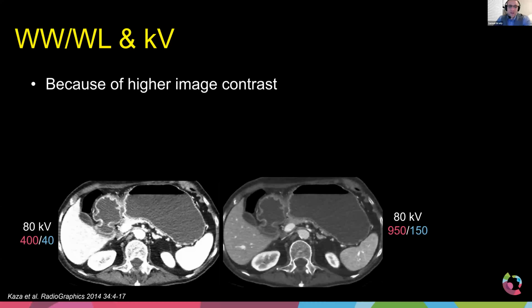All right. Now, the other thing you have to optimize is the actual appearance of the image to our radiologists. So you have gone in, you've dialed your KV down, now you're routinely imaging, let's say at 100 KV or maybe even lower. You maybe even were able to reduce the contrast and concentration, the iodine concentration. I mean, you figured out all these optimizations that you've done. But when you actually acquire it at a lower KV, because of the intensity of the CT numbers, because they are different at lower KVs and higher KVs, the images will look different to the radiologist.